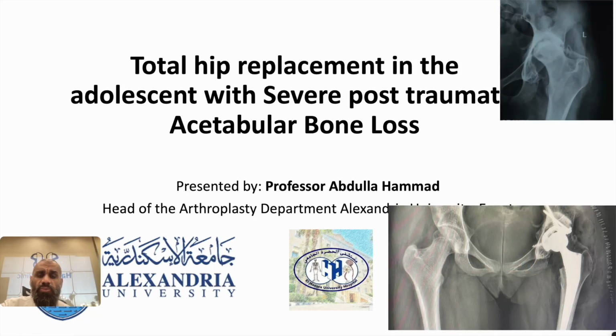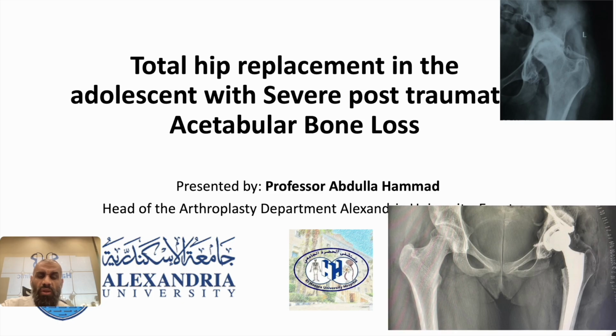This is Professor Abdullah Hamad from Alexandria, Egypt. I will present a case of total hip replacement in an adolescent female with severe post-traumatic acetabular bone loss.